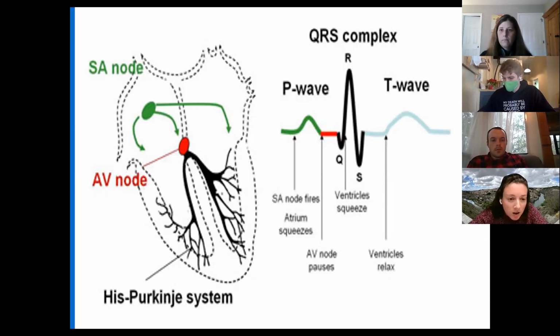Go ahead. So when you say what part of the heart, are you talking about like where it's saying whether it's an inferior, lateral, septal, or anterior lead?